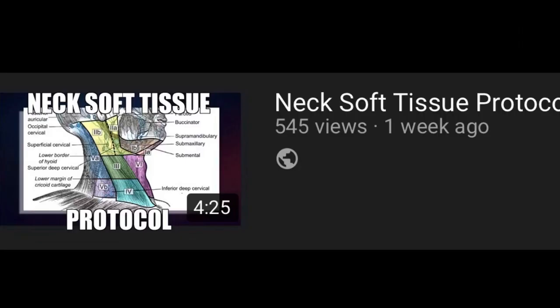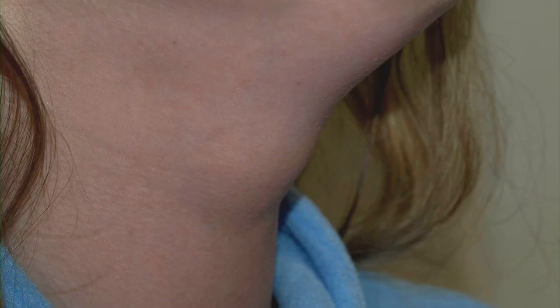I did a video of the protocol for that the other day — I'll link to that. The most common location is just above the thyroid, between the thyroid and the hyoid bone, but you can see a thyroglossal duct cyst in the submental region, and in rare cases you can see it lateral in the submental region.